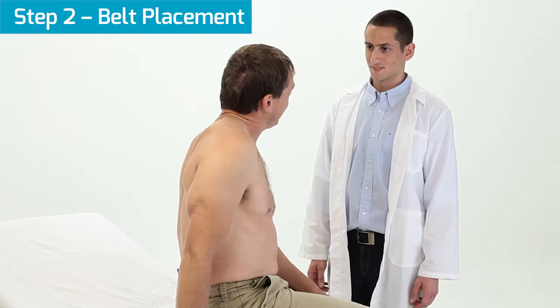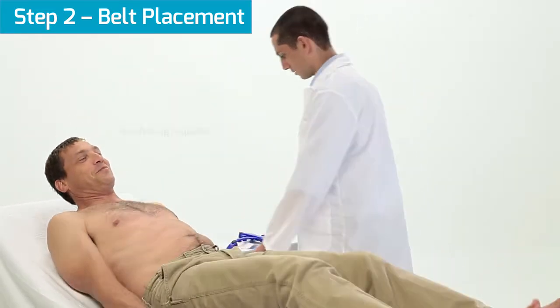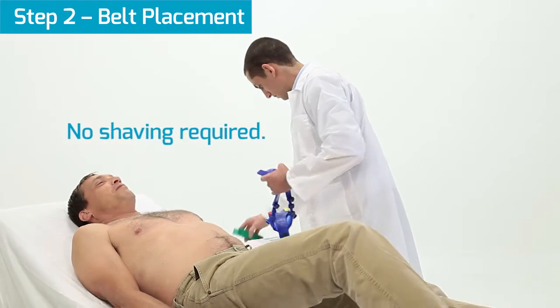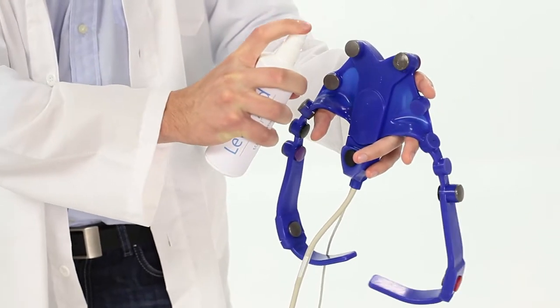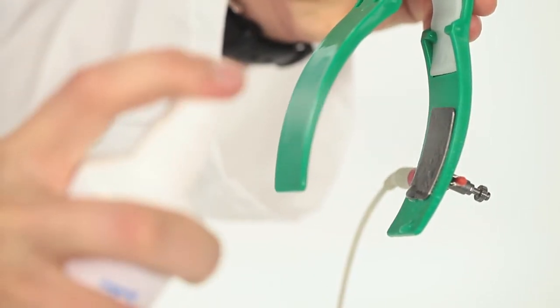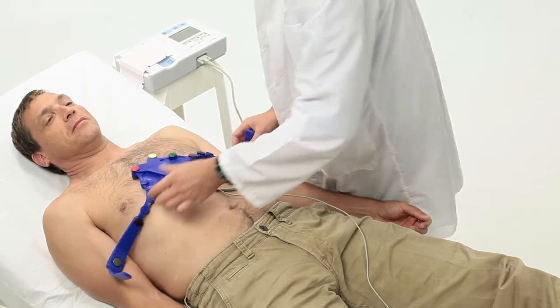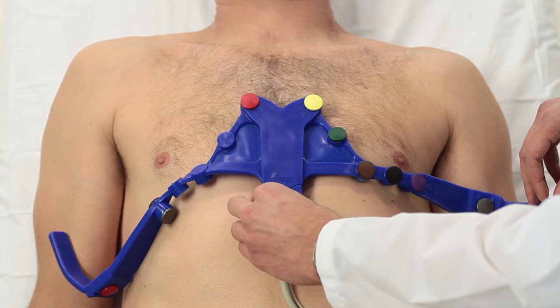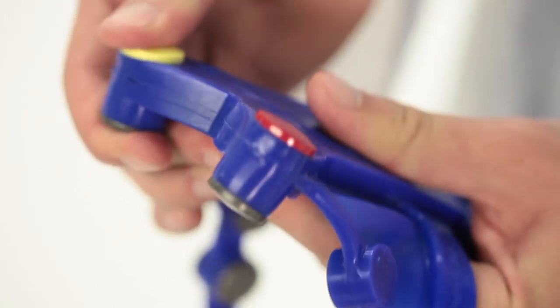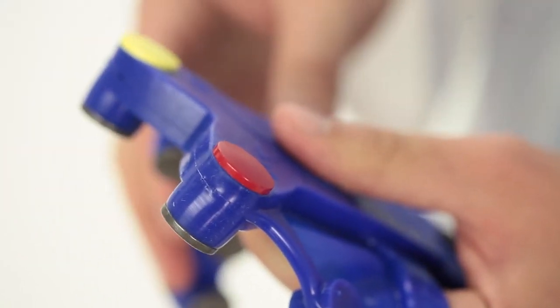For the second step, ensure the patient is lying comfortably on a flat surface. Note that there is no need to shave the patient. Wet the electrodes with our LevMed electrode conductive spray. Place the ECG belt on the patient's chest with V1 and V2 symmetrically on both sides of the sternum. If needed, V1 and V2 may be slightly bent to ensure good contact is achieved.